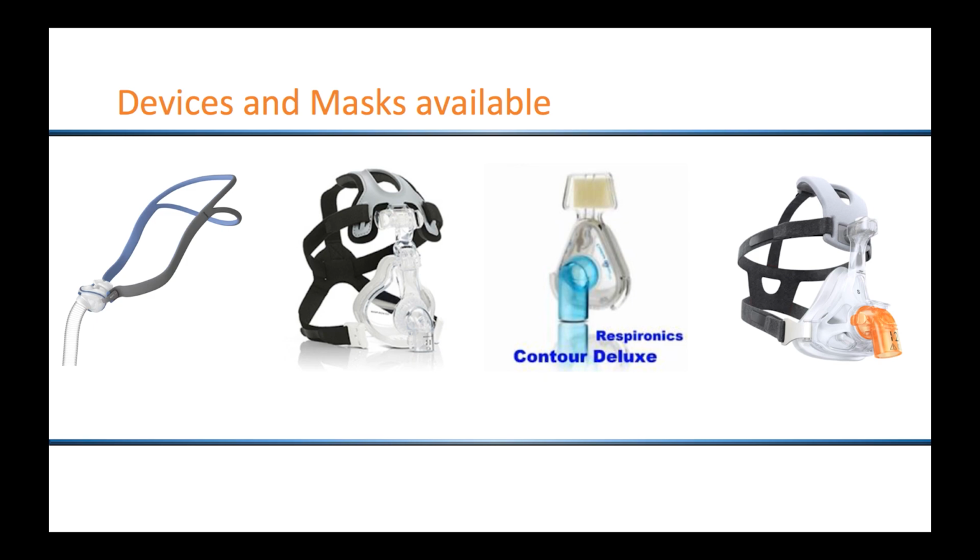In addition, these are the 4 different masks that are currently available inpatient for patients that do receive positive airway pressure. Keep in mind, if patients are having comfort issues after a few days and you've trialed a few of these masks, you could always reach out to Sleep Medicine, and we do have access to additional masks at our sleep center at the Ford Pavilion.